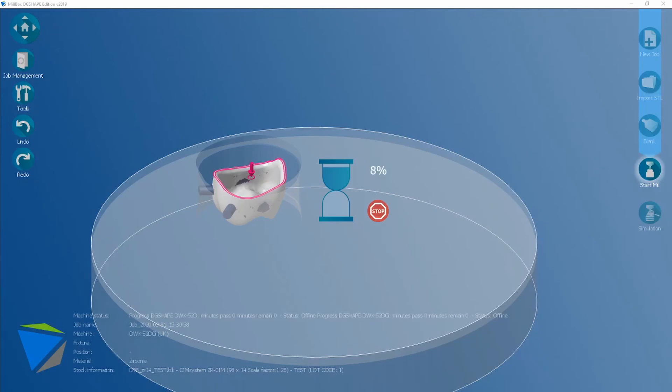The job starts calculating and that's it. That's the simple crown and bridge workflow within Millbox. Thank you.